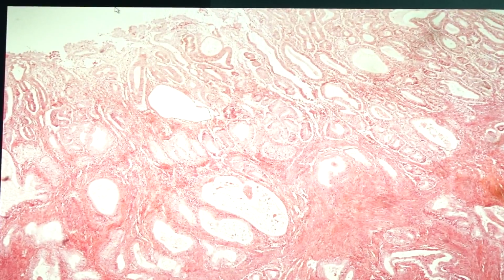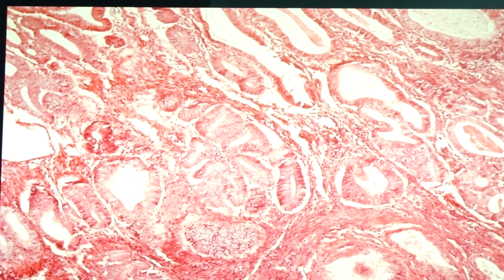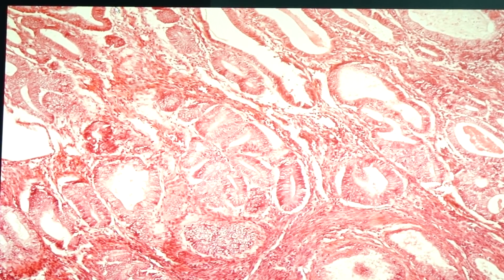So slide 75. This is endometrial carcinoma. So this is in the endometrium. With regards to endometrial carcinoma, first we go into the two types.